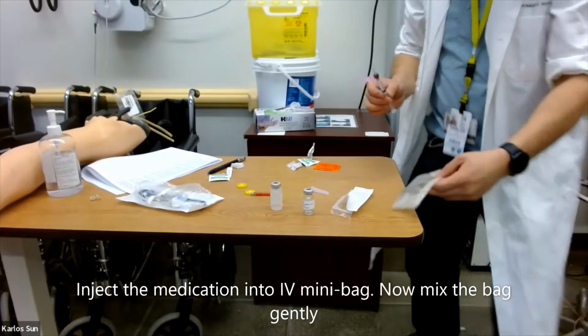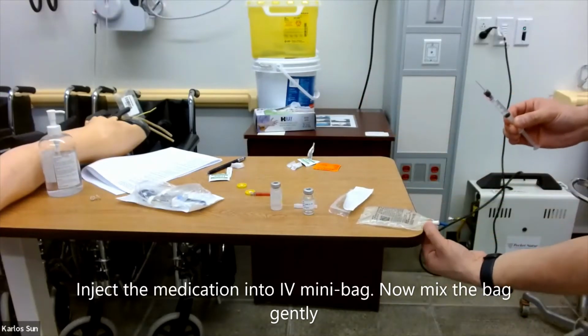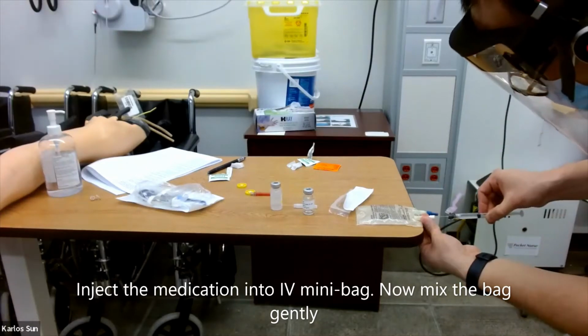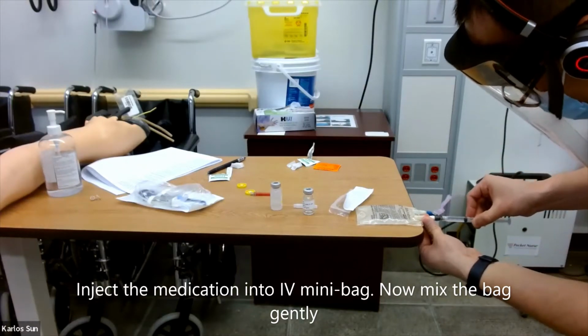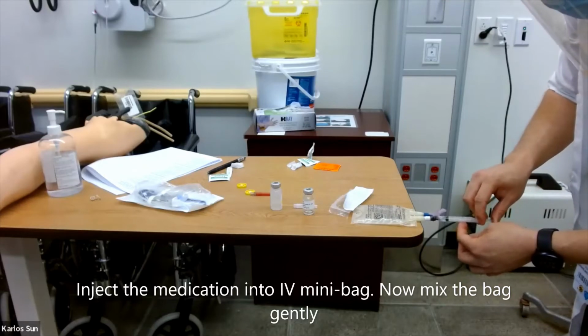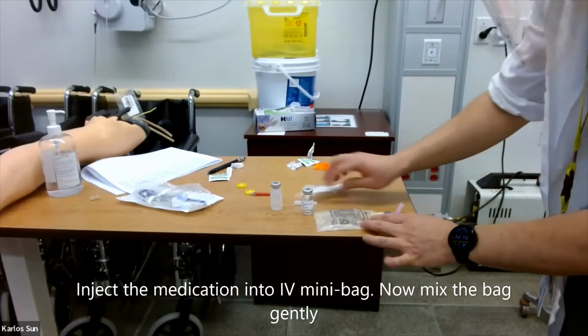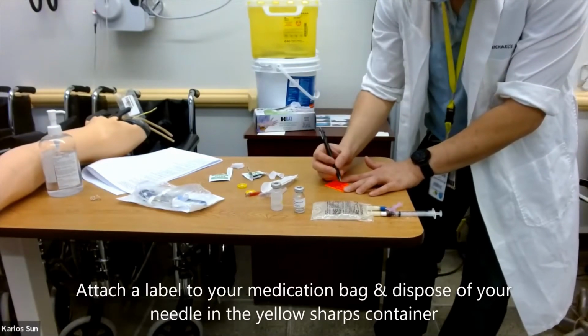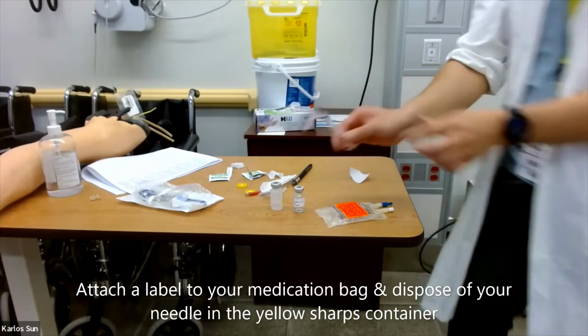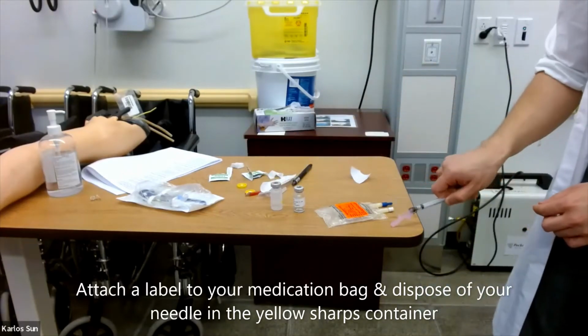Be careful not to poke yourself or puncture the bag at this point. Now immediately attach a medication label to your bag and dispose of the needles in the Sharps yellow container.